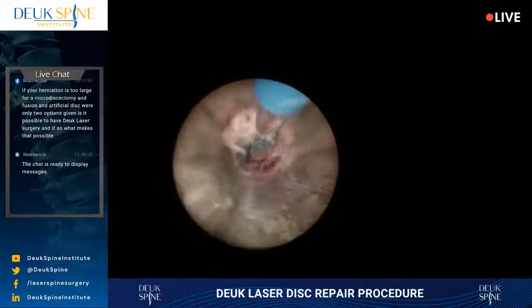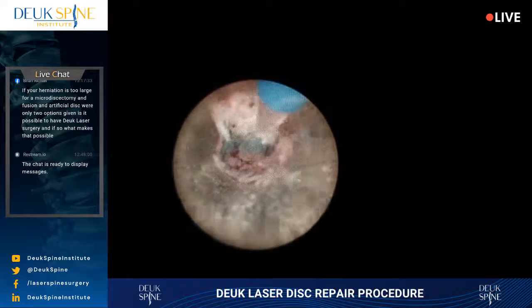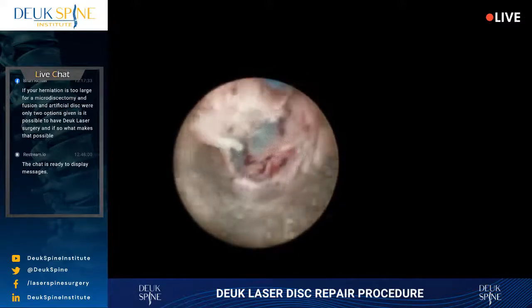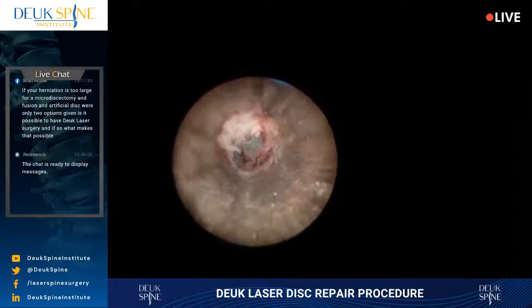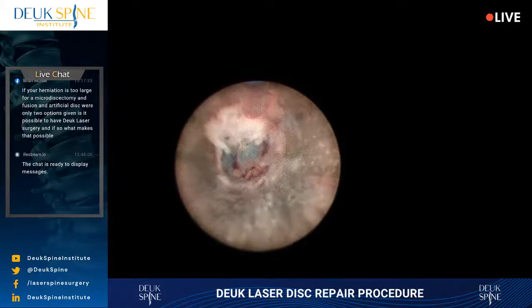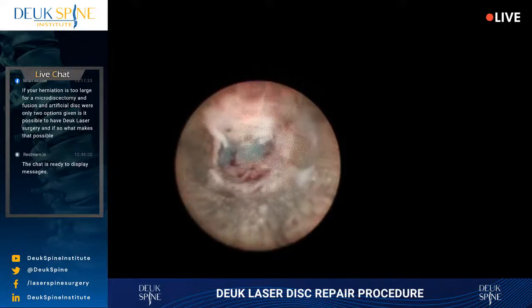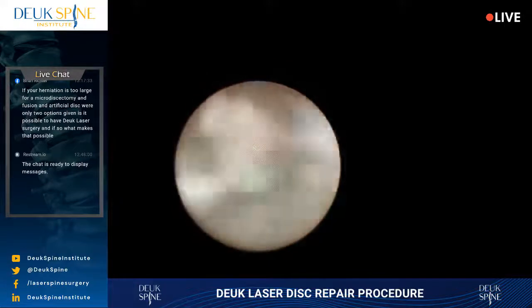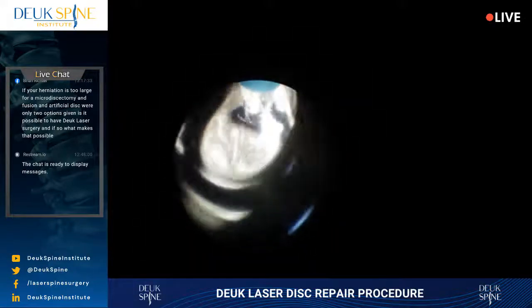I know, but I need you to actually succeed. Don't work on it. Finish working on it. Are you ready? What are we waiting for? Is there a reason I'm waiting? Tell me. Huh? All right. Almost there. Oh boy. You've got to have that ready sooner so we don't have to wait. There's a piece of herniation there. See if I can grab it out.